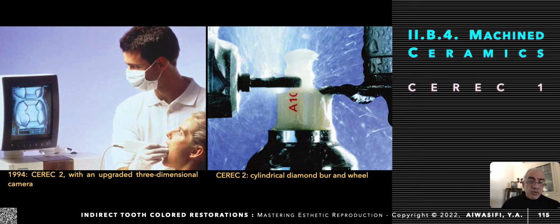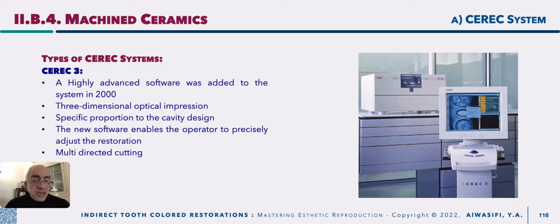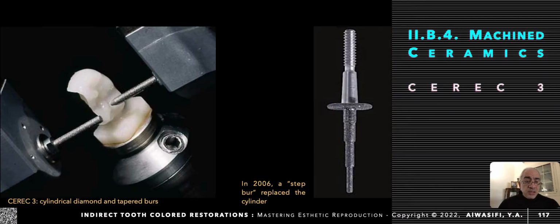operators expected. Then comes CEREC 3 in the 2000s. It's a highly advanced software system with three-dimensional optical impression and specific proportion to the cavity design with satisfactory marginal accuracy. Also, the new software enables the operator to precisely adjust the restoration. That's why post-cementation adjustment is limited, with multi-directed cutting, and in 2006 a stepped bur replaced the cylindrical one.